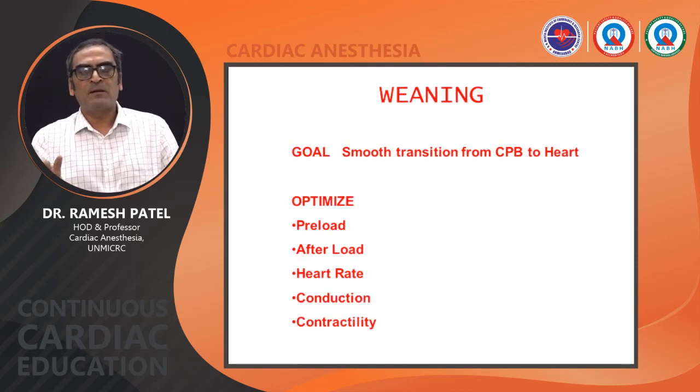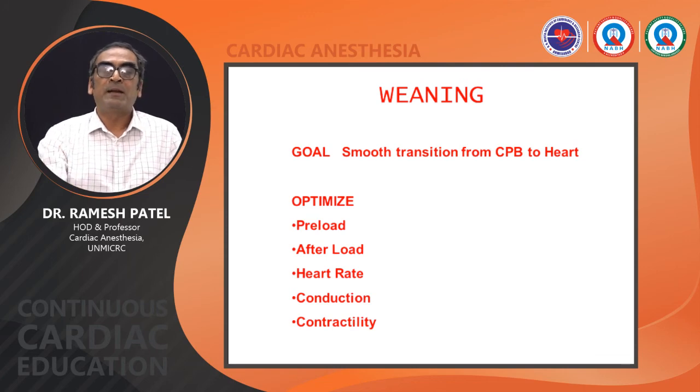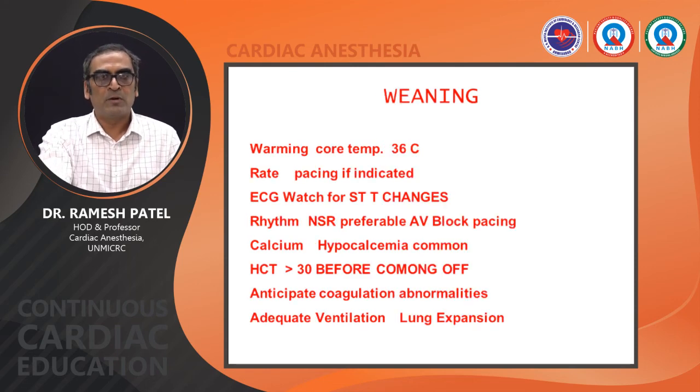Now, after all this, we need to wean the patient from the CPB pump. The goal is a smooth transition from the CPB to the heart. Before weaning from the CPB, we must optimize some factors like preload, afterload, heart rate, and contractility, by direct visualization, or if you have transesophageal echocardiography, then we can visualize on screen.